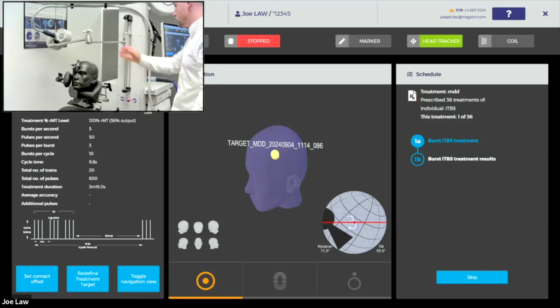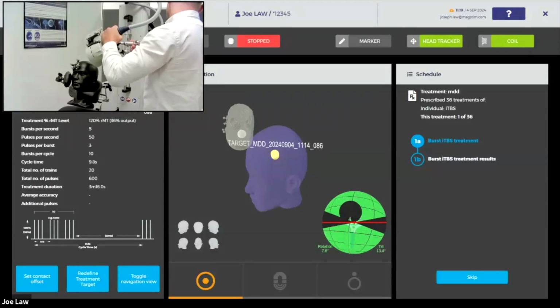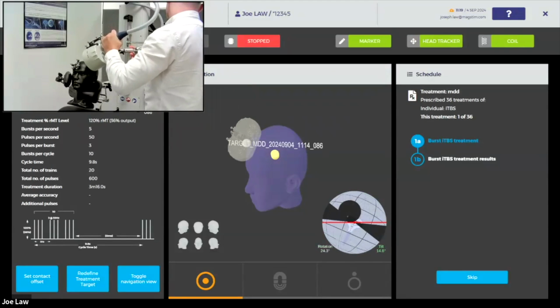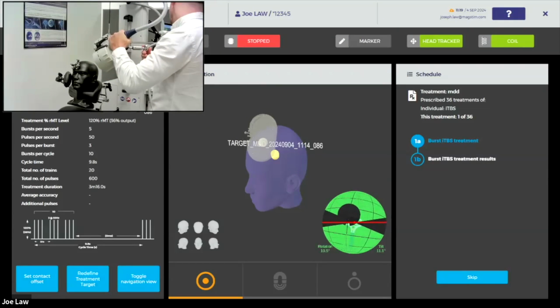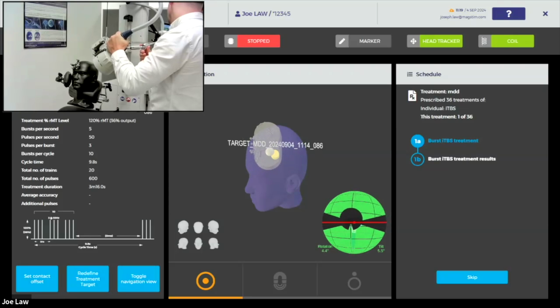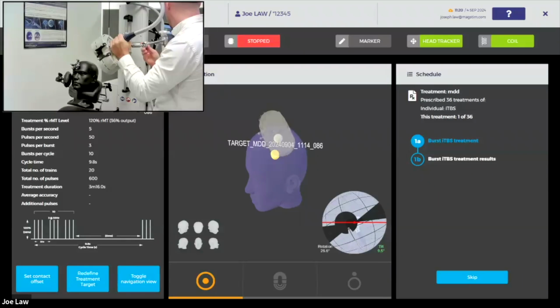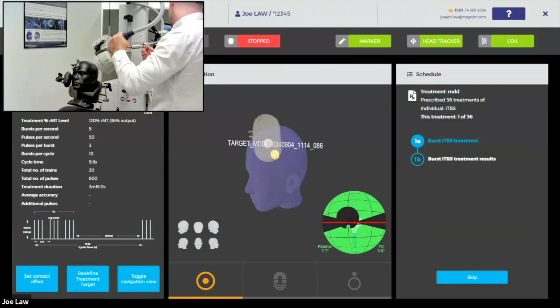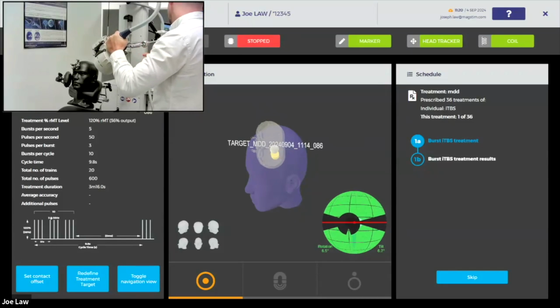So if I just show you that quickly, I'll grab my treatment coil. And what you'll notice is as I move this coil around, you can see the orientation and the coil on the screen moving. So even though I'm nowhere near the head at the moment, I can probably get the orientation correct. So you can see here, that is the ideal location for the orientation on the gimbal. If I rotate my coil, you'll notice the black bat wings move, they rotate. I can get them back in and it goes green. If I tilt it, we see the ball move. If I tilt it forward. So every parameter is looked at with regards to the coil.